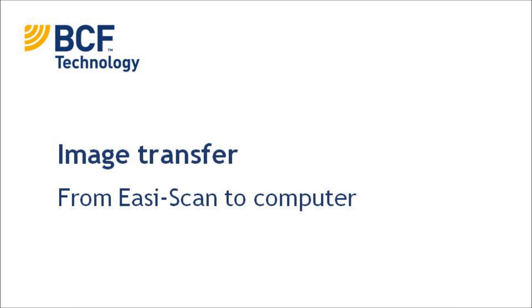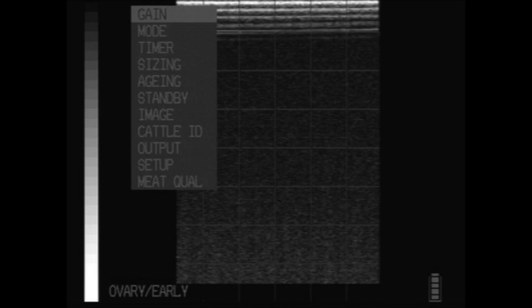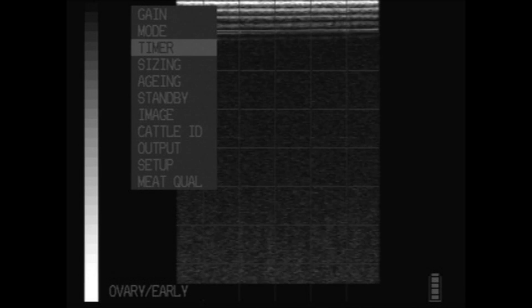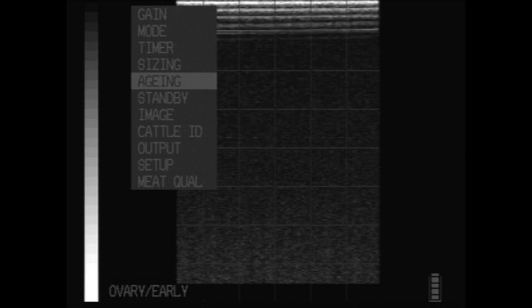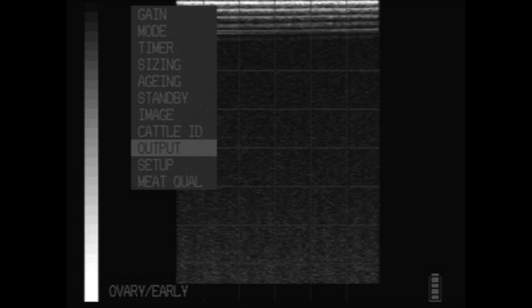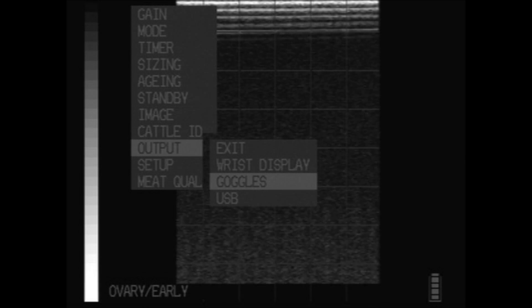In order to transfer images from your Easy Scan to your computer, first plug in your goggles and change the output setting. To do so, select the square button and then use the down arrows to get to output. Select the square button again and then use the down arrows to go to USB. Then select the square button again to select that.